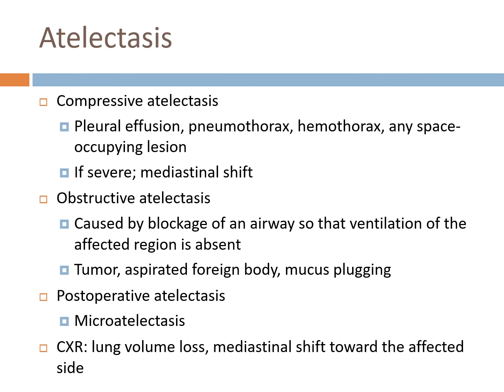That's why it's so important post-op to see our patients, to instruct them on how to use the incentive spirometer. It's something I don't think you'll ever see go away, even though they say it doesn't help in the long run. But I think it's just the idea that it's sitting there next to the bedside, people see it, and hopefully use it or just remember to take big breaths, get out of bed. I mean, you'd be surprised, some people just don't want to move, they just want to lay there.